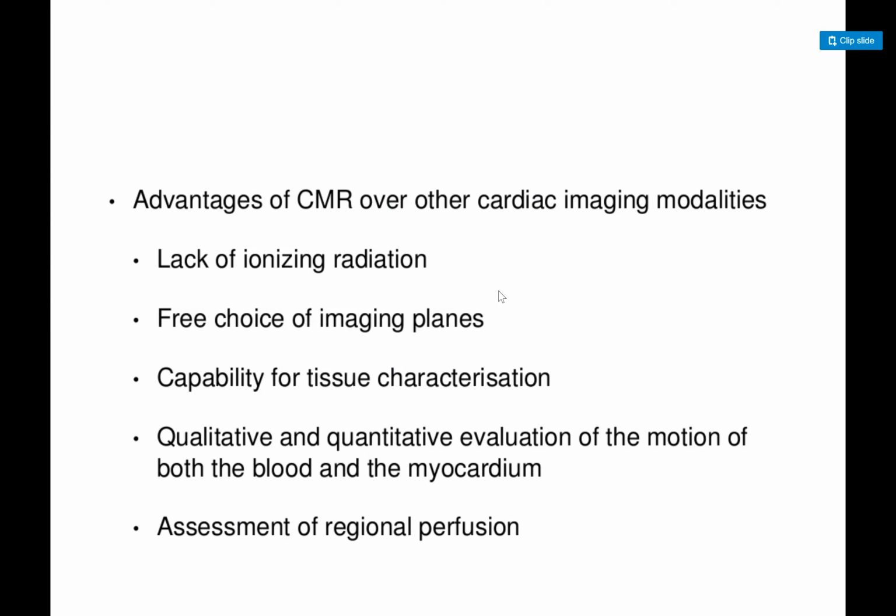You can choose any imaging plane to do it, but it's not like CT scan where you can do a 3D reconstruction in this. We usually do not have 3D reconstruction available, so that's a downside. It's in research, it's available, but you have to take a plane through which you are imaging, just like echo. If you do not take a plane, then you cannot do the proper imaging, and that can happen in MRI.